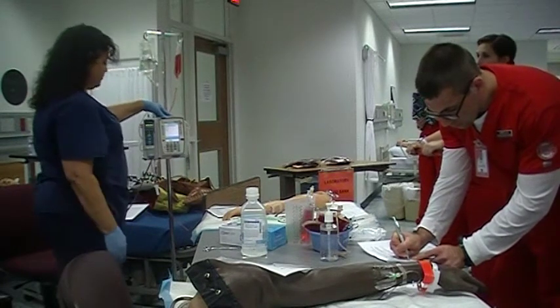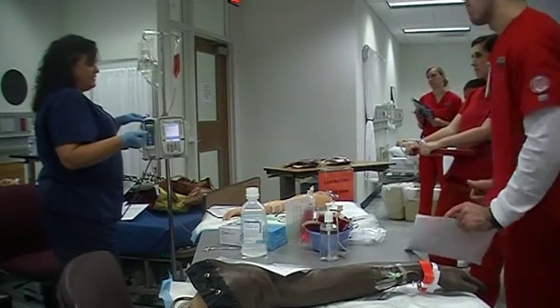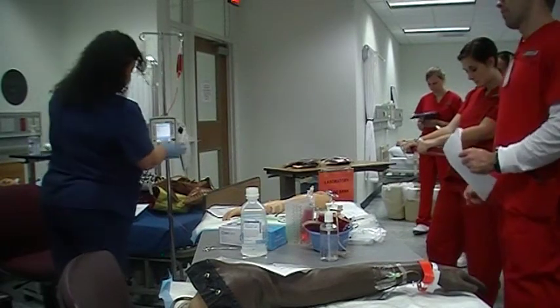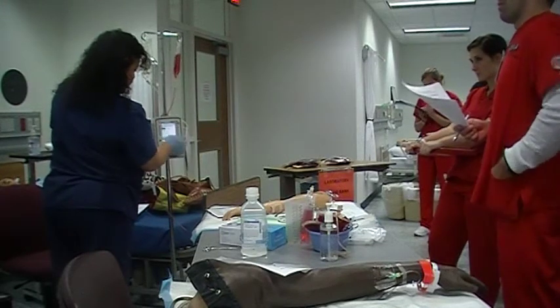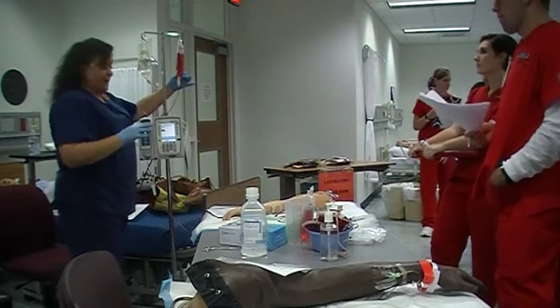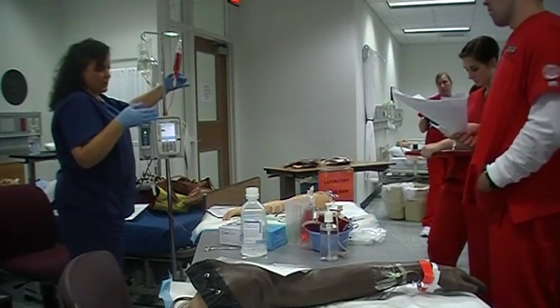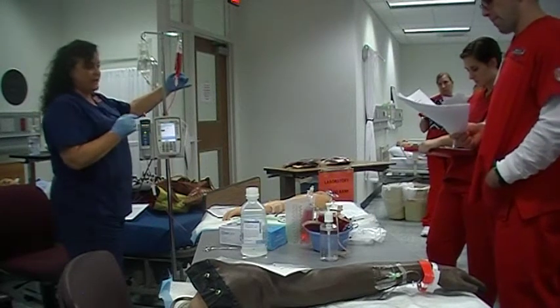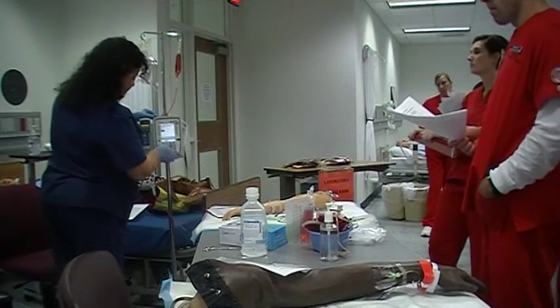And then it's going to ask you the rate. According to your skills book, we start blood at 2 mLs a minute, which is how much an hour? I'm going to put it in for 120 mLs an hour. And the volume to be infused, a normal blood bag is anywhere from 350 to 500. We usually put 400. It says on the bag, and I'll show you when we're in clinical how to figure that out. Doesn't matter though. Volume is 400.